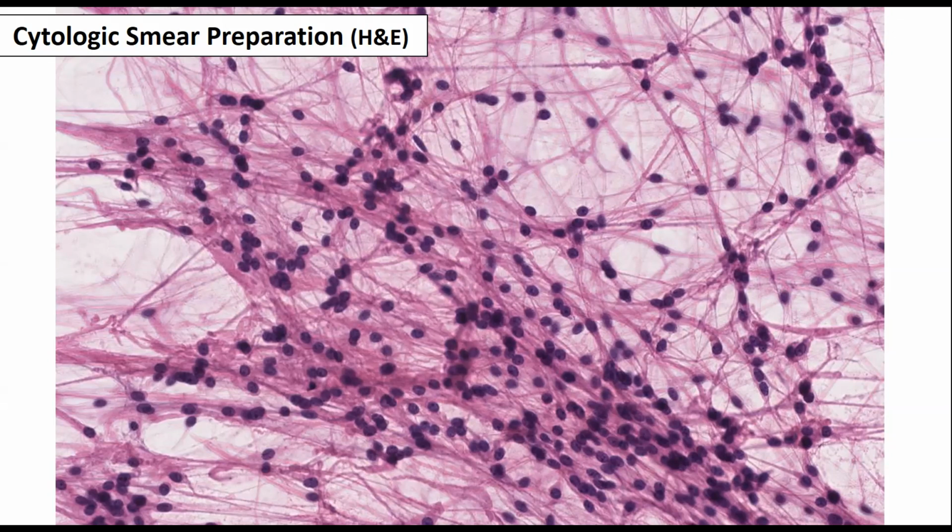Now, this is where some experience comes in, because if you didn't have experience and you're looking at this, you're saying, oh, look at all those fibrillary cell processes. This must be an astrocytoma. And that's why I wanted to show this: ependymomas at any location mimic astrocytoma with respect to the cytoplasm. But very few astrocytomas are going to be this cellular with this low degree of irregularity. Everybody got it?